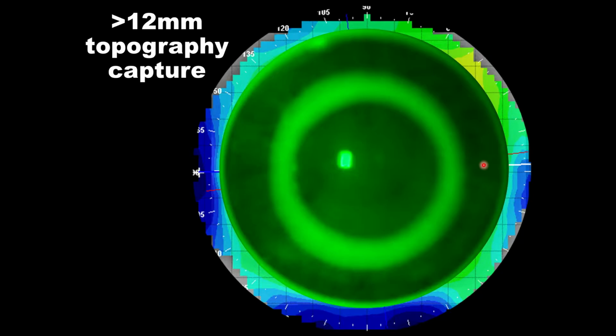This composite eye feature is beneficial in many ways. Not only does it help us to understand the eye shape, but in terms of the rigid contact lens we're about to apply, we want to know the shape that we need for the alignment zone. We want to know the edge lift that will be required, the depth that goes all the way to the center.